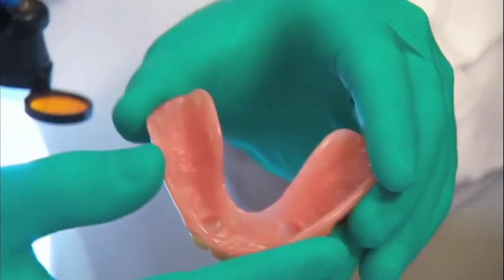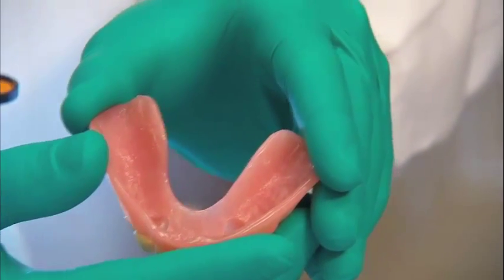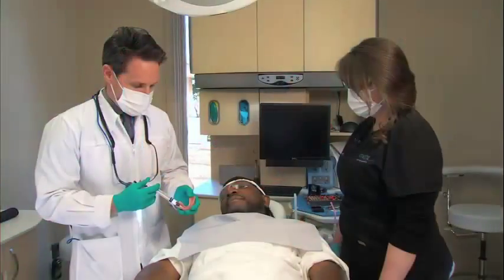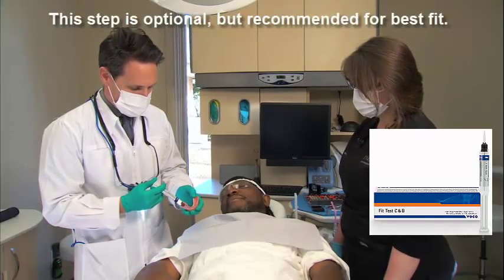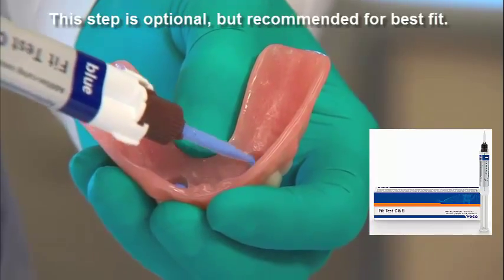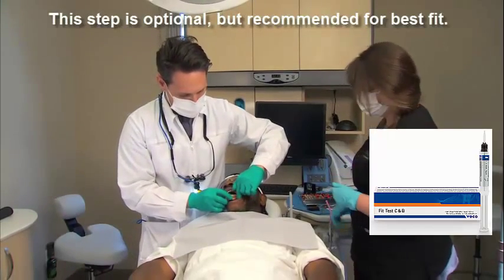We have the denture that's already been relieved and we're going to use the first product in the VOCO Quick Up Kit called Fit Test C&B. That's going to make sure that we have enough clearance around the attachments. We want to fill the relieved areas about two-thirds full to make sure we have enough material that will flow around those attachments and show us if we have any under-relieved areas.